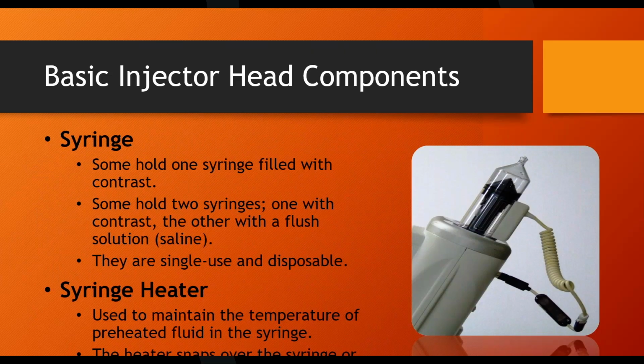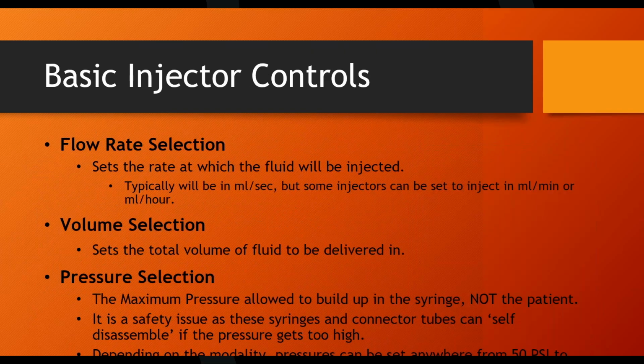Now, that's true for both CT and MRI injectors. Angio injectors don't use saline. Angio injectors are all just single head injectors, just one syringe, and it's just the contrast syringe. And I talked about the heaters and the purpose of the heaters. I already dealt with this, all right.